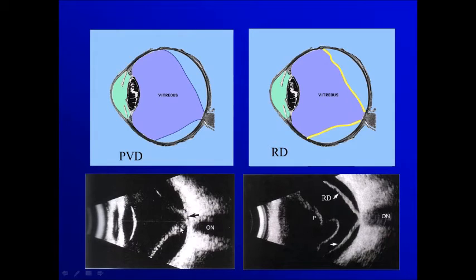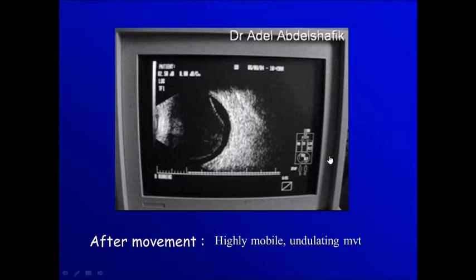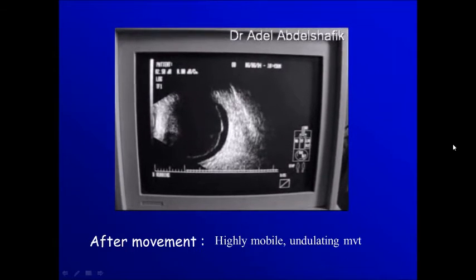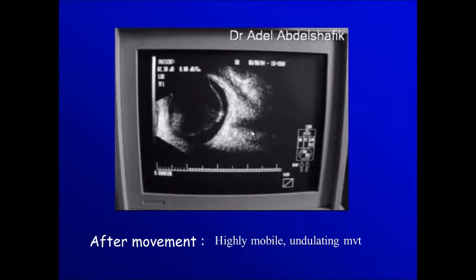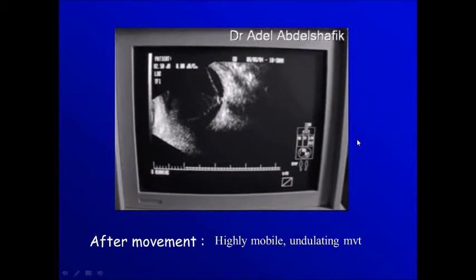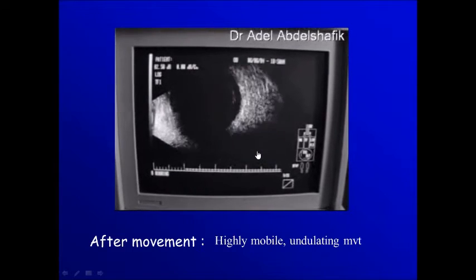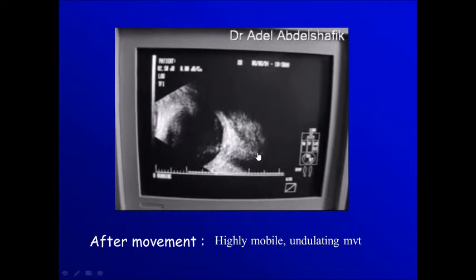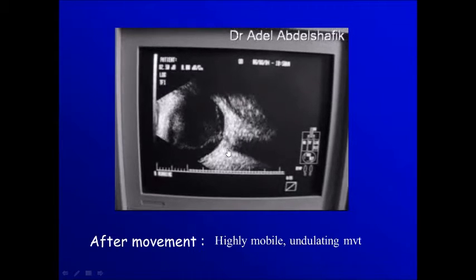You notice here the difference between this membrane — it seems eccentrically attached — and this membrane attached to the center. Sometimes we can see on the posterior vitreous detachment condensations representing the Weiss ring. Here we get the optic nerve, this is a muscle, and we have a membrane here in the vitreous cavity. You can see this membrane is still attached to the disc but only at an eccentric location.